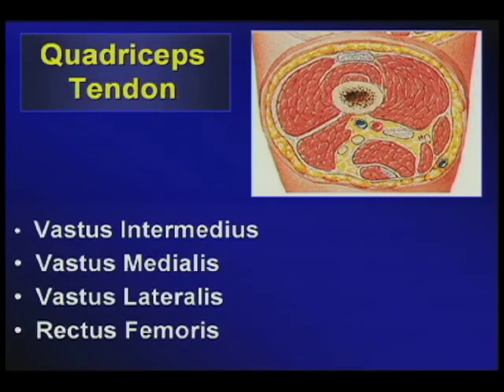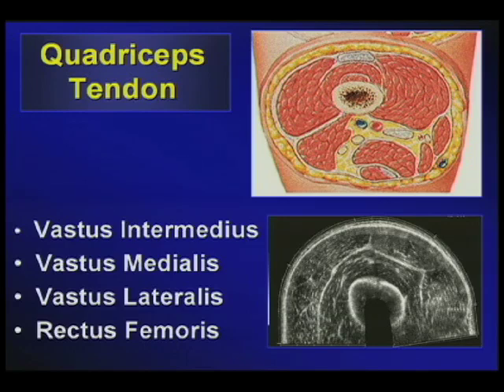If you look at the long axis view with an extended field of view, you can also catch the portion of the knee and thigh in a short axis view. Here you could note on the grayscale imaging the equivalent counterpart of Dr. Netter's drawing. First, the bone acoustic landmark of the circumferential femur. Here you can see it on Dr. Netter's drawing.